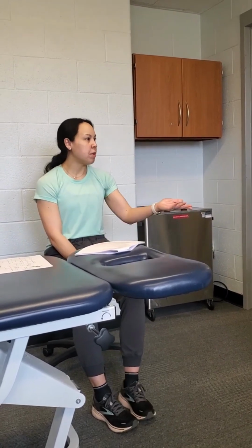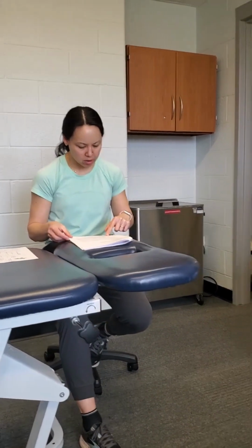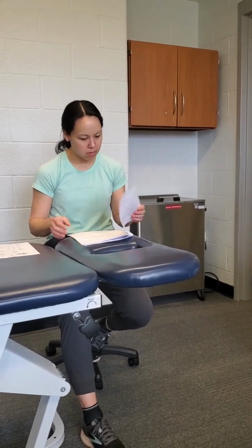Yeah. Totally. And that would be your starting point, right? Yeah. And then if they get through the 75 reps and they could have done more, then add a 1 pound ankle weight, or 0.5 or whatever. Gotcha. Okay, yeah, certainly.